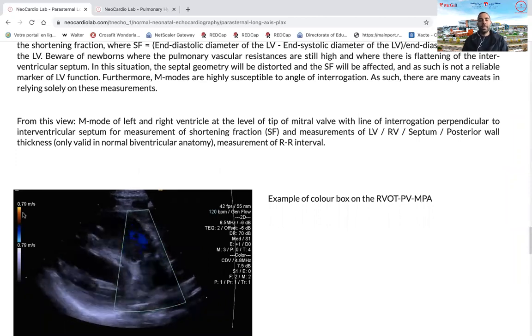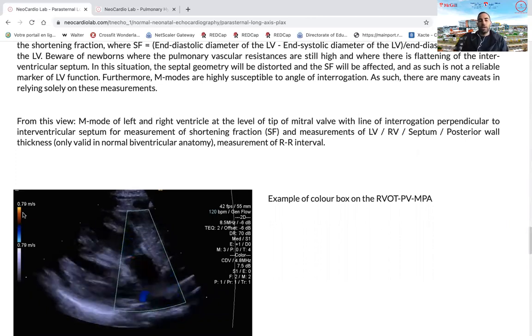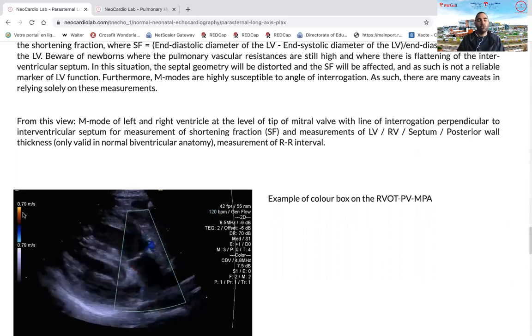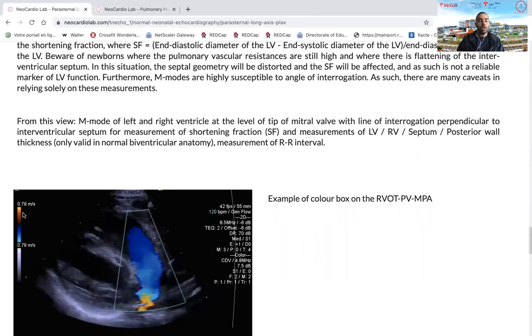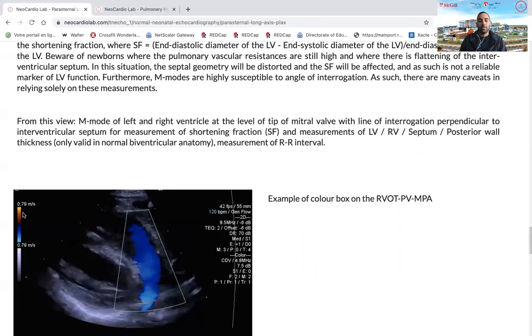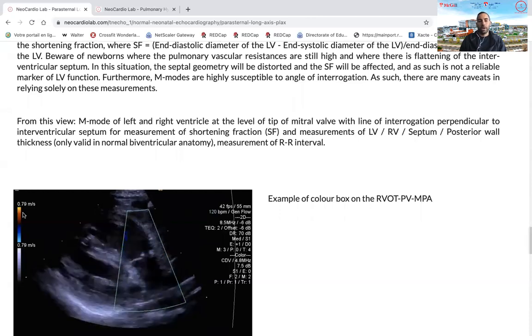And in a lot of cardiology labs, on the first echo, if a scan is being done to rule out VSDs, you should be scanning your ventricular septum in all the possible views, looking at all the areas: the inlet, the outlet, the perimembranous area, as well as the apical and muscular septum.